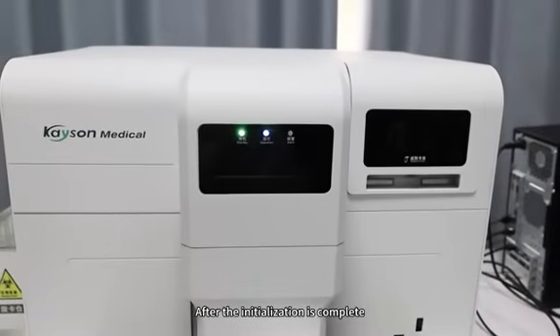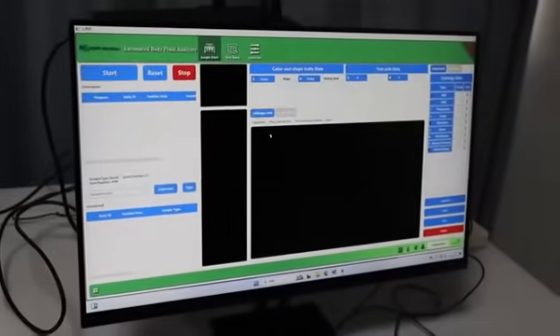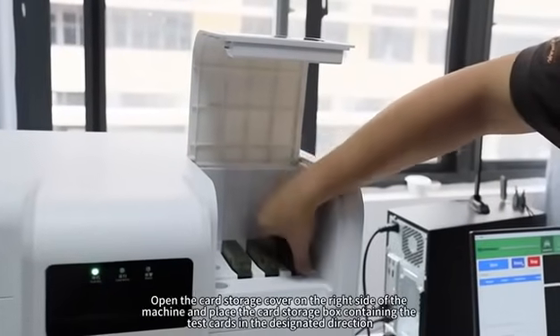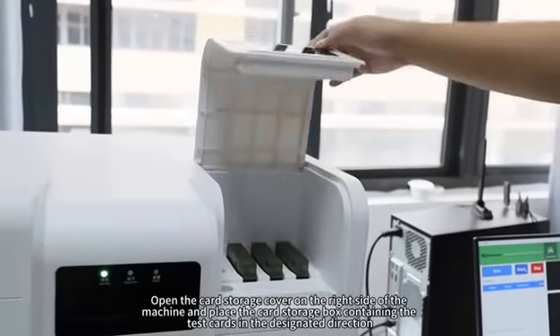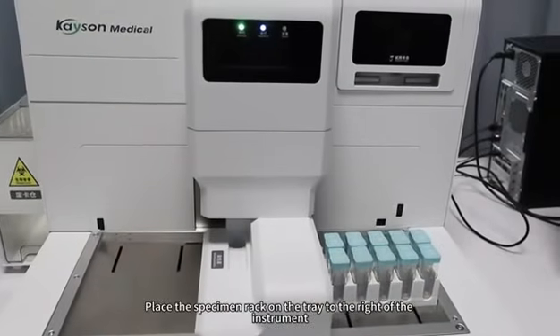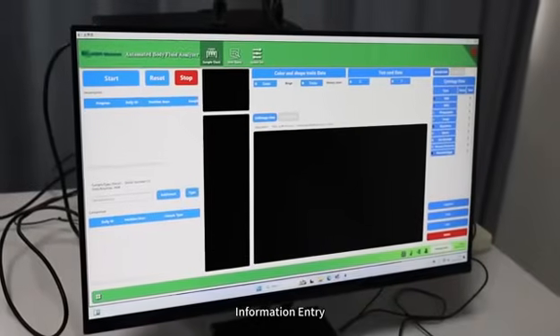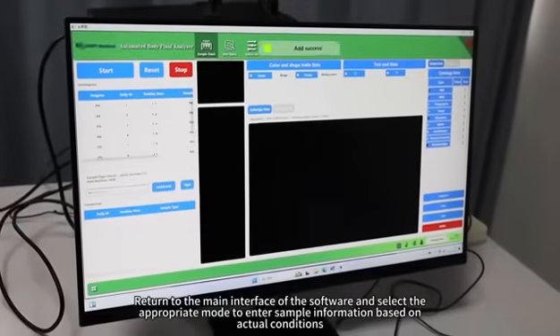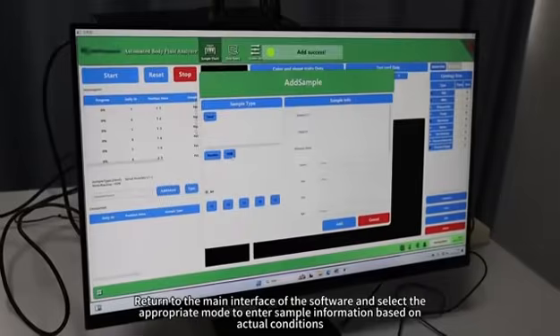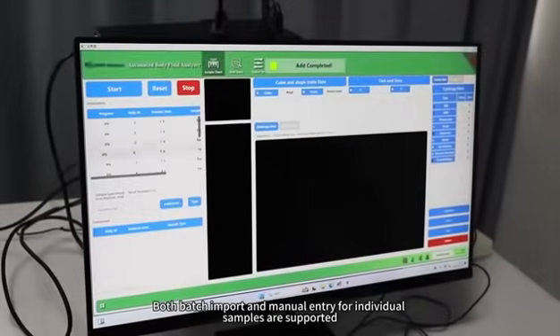After initialization is complete, follow the screen prompts and click Confirm. Sample Loading: open the card storage cover on the right side of the machine and place the card storage box containing the test cards in the designated direction. Place the specimen rack on the tray to the right of the instrument. Information Entry: return to the main interface of the software and select the appropriate mode to enter sample information based on actual conditions. Both batch import and manual entry for individual samples are supported.